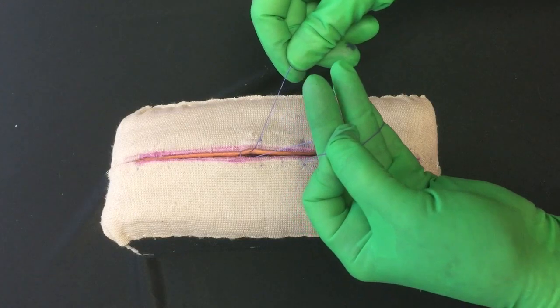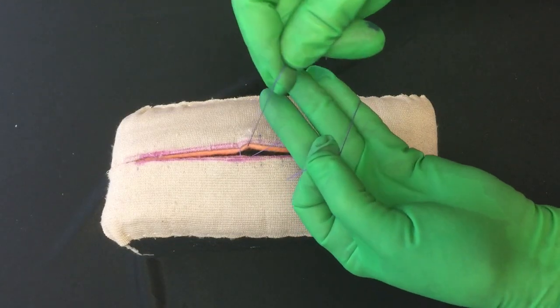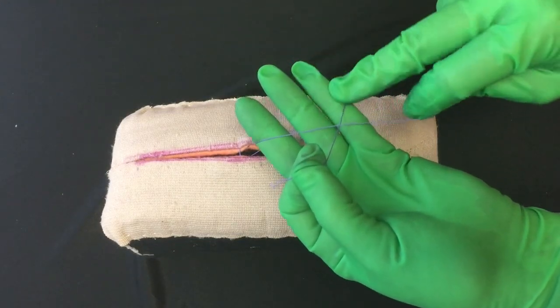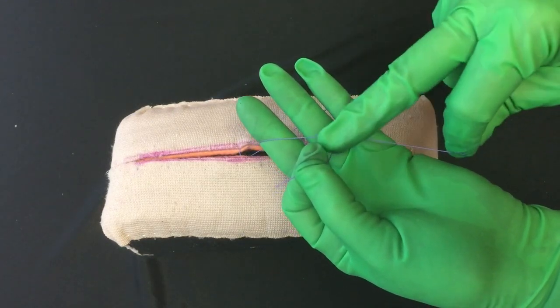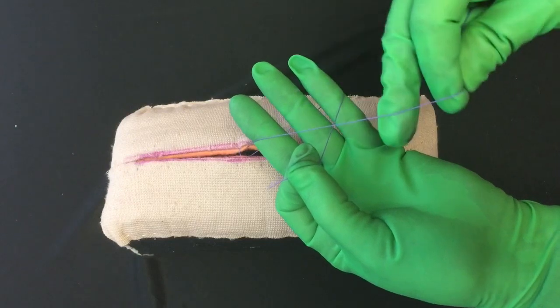So I turn my palm, now I lay it across, and what's important—I'm stretching here and here—what's important is to see that X. You want your hand that's doing the throw with the suture underneath the other one.